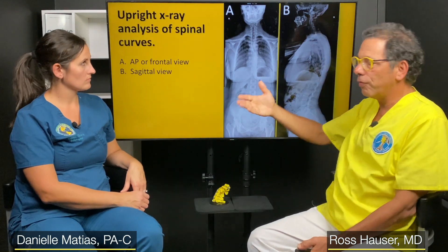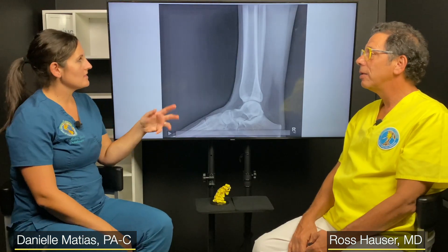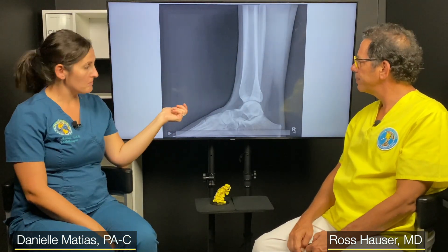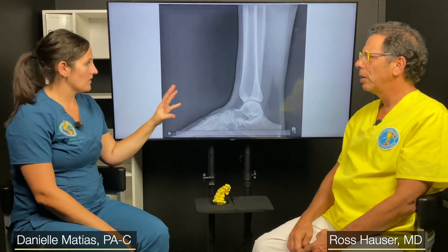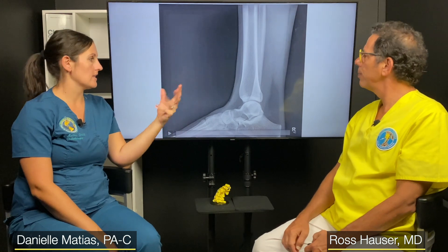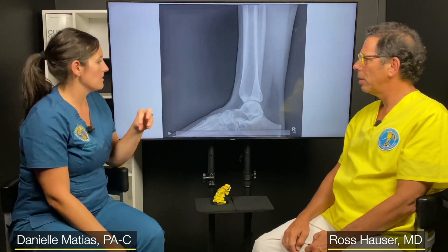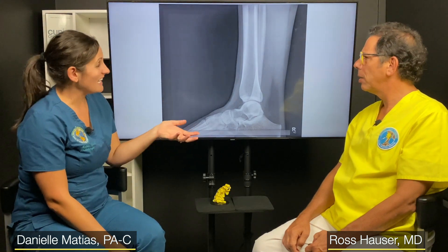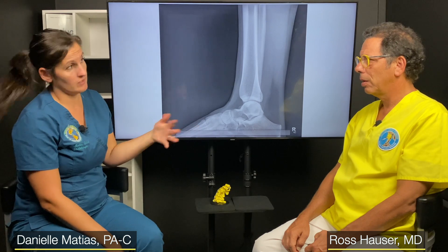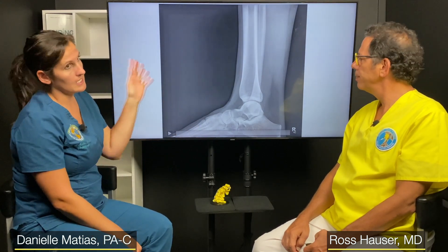With this x-ray we can take a static film — a regular film where they're not moving — and once we have a good image, we can have the patient do certain maneuvers and look to see if there's joint gapping, whether there's more space in certain joints. A really useful thing is if somebody has a bad right ankle and a normal left ankle, we can compare the two — which is very interesting to see how one is more unstable than the other.